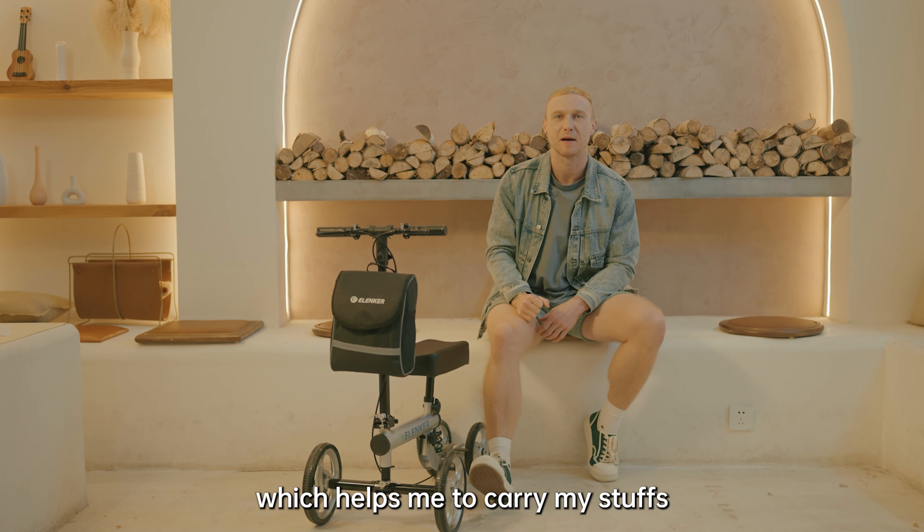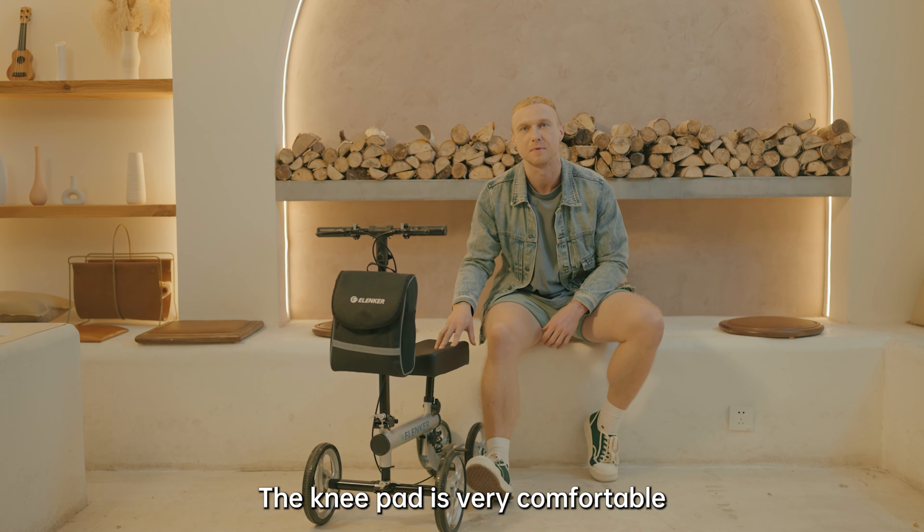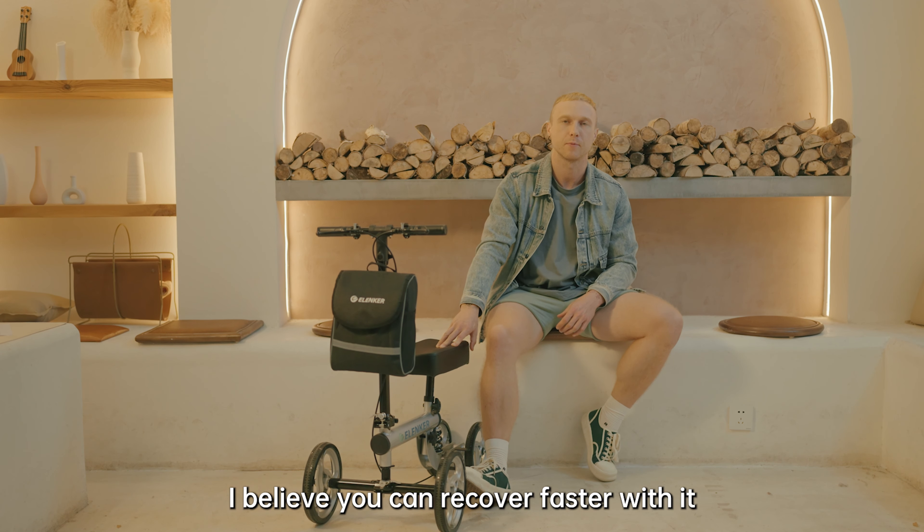The knee pad is very comfortable. I believe you can recover faster with it.